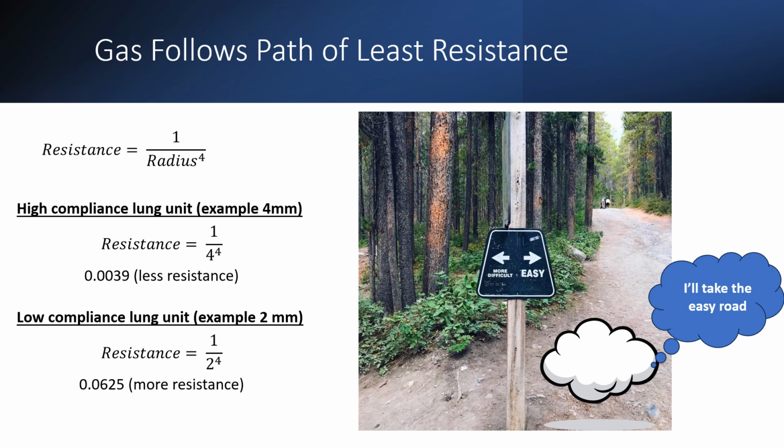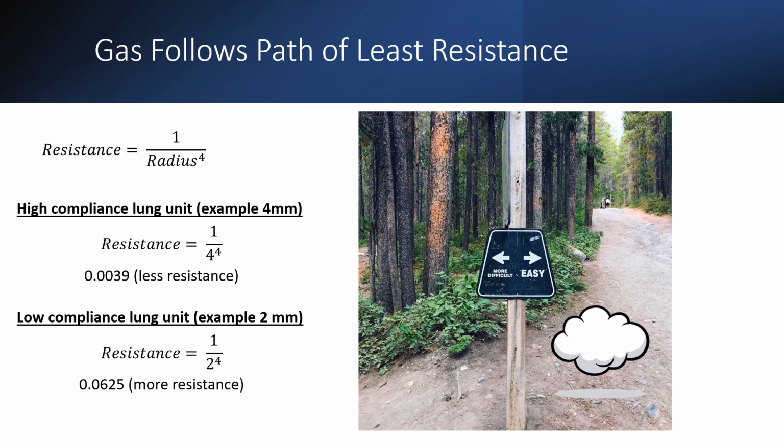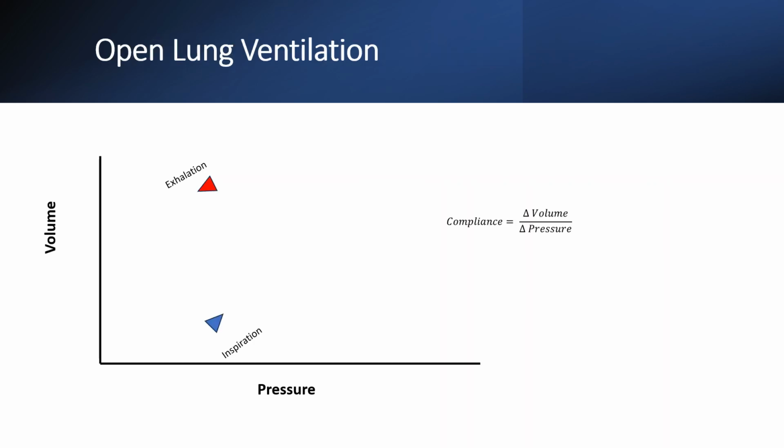Airway resistance also determines how inspiratory gas is distributed in the lungs. The inspiratory gas must overcome the elasticity of the lung units, and airflow will always follow the path of least resistance. The faster the inspiration, the less gas will enter lung units with high resistance or low compliance. This prevents lung units that are damaged or narrowed from experiencing high pressures, such as alveoli damage from pulmonary interstitial emphysema.